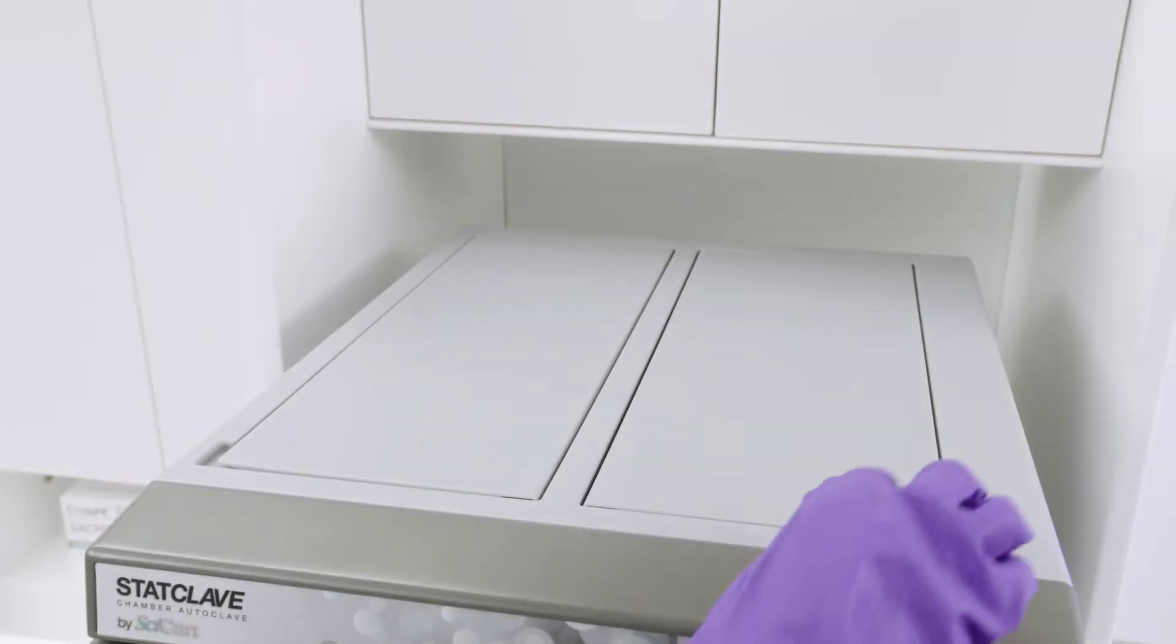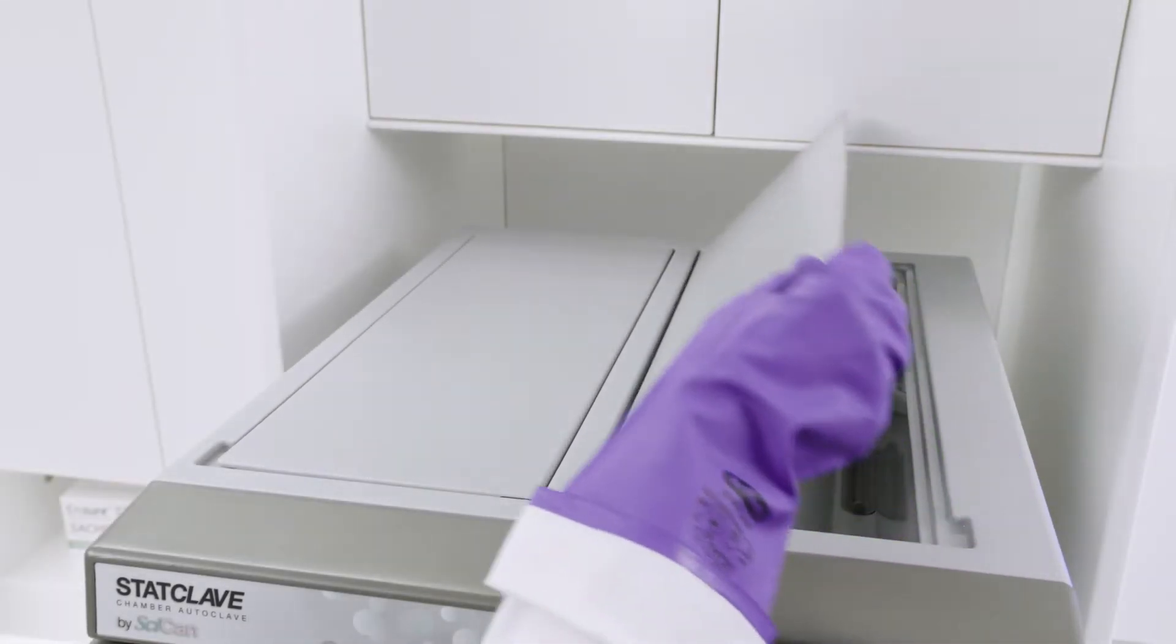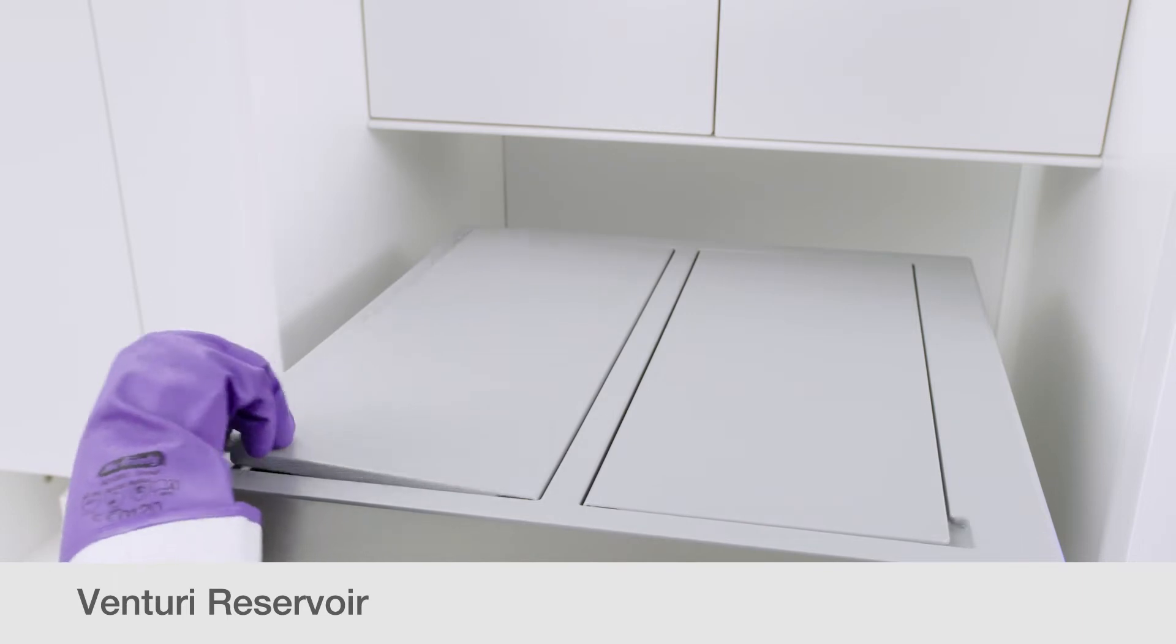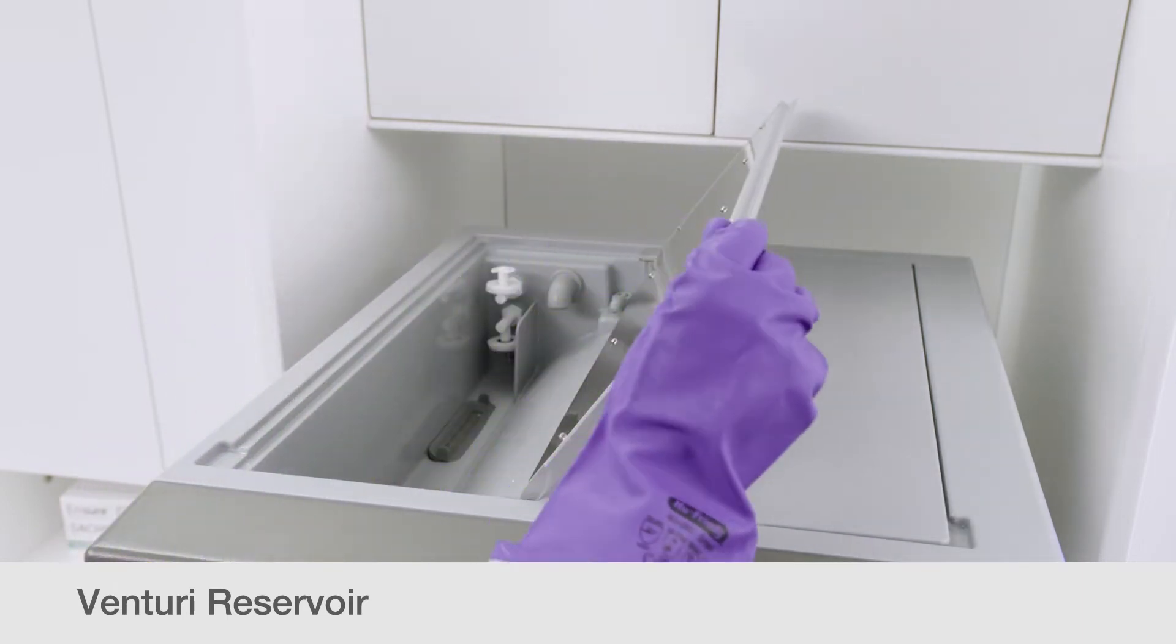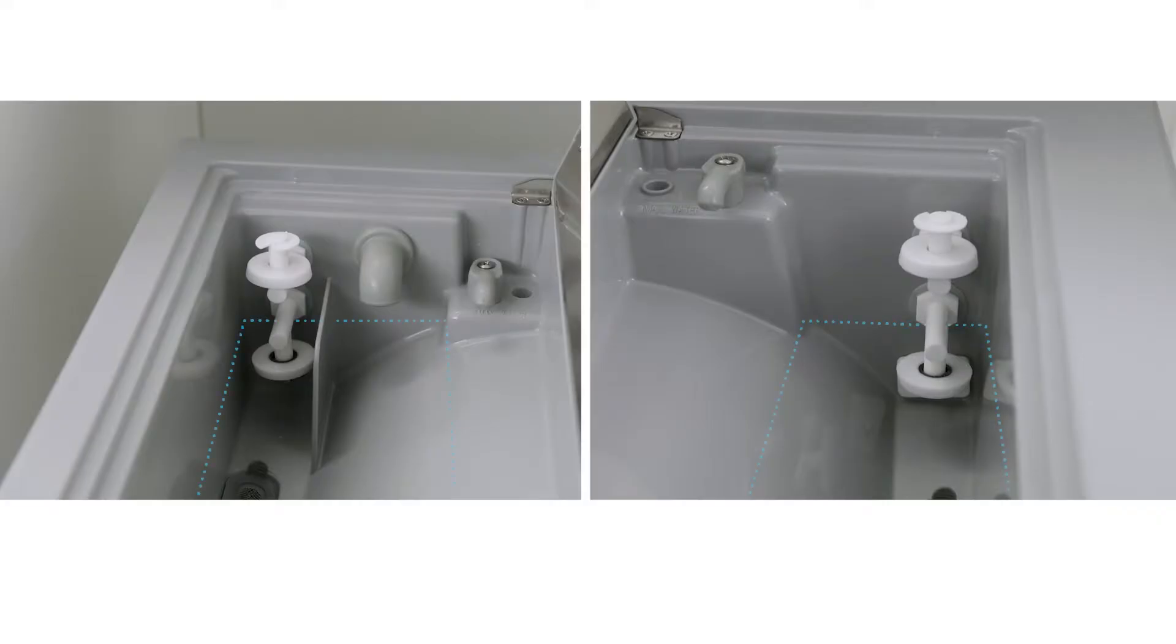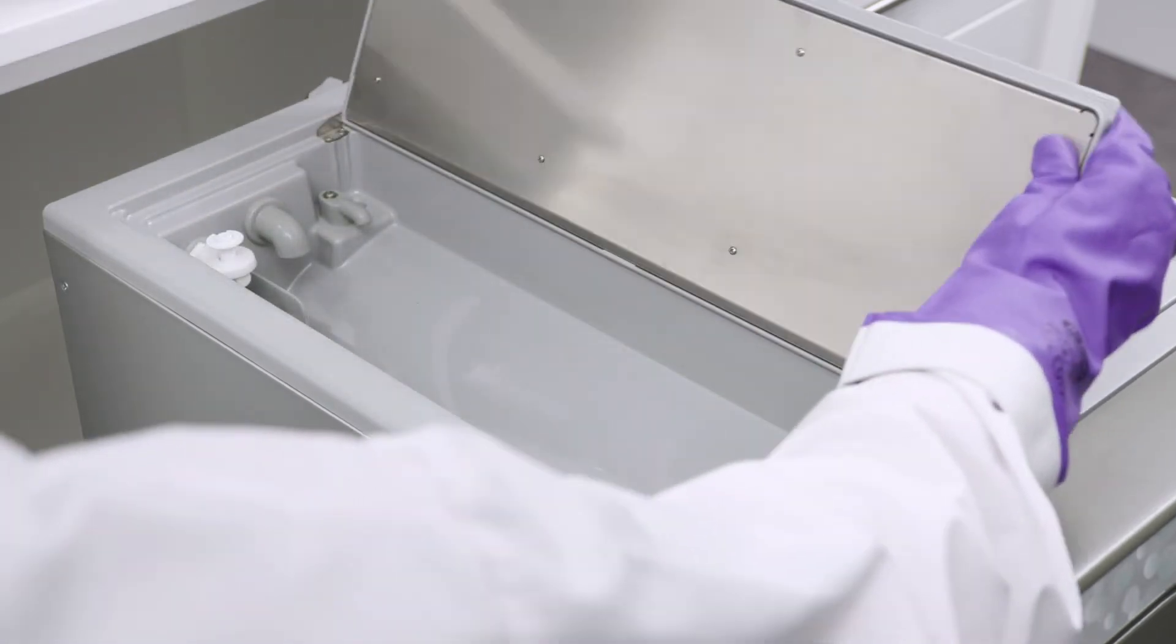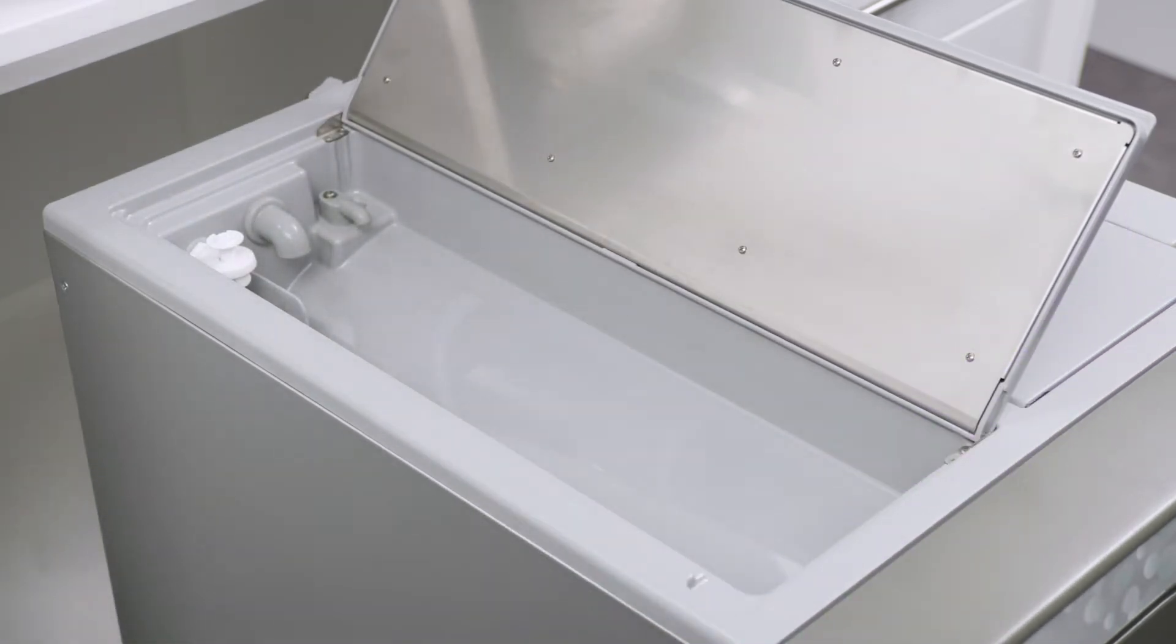The StatClave has two accessible reservoirs on the top of the unit. The Clean Water Reservoir is located on the top right of the unit and the Venturi Reservoir on the top left. For the unit to operate, reservoirs must contain the minimum required water levels. The StatClave unit uses water from the Venturi Reservoir to generate vacuum draws at the beginning and end of each cycle.